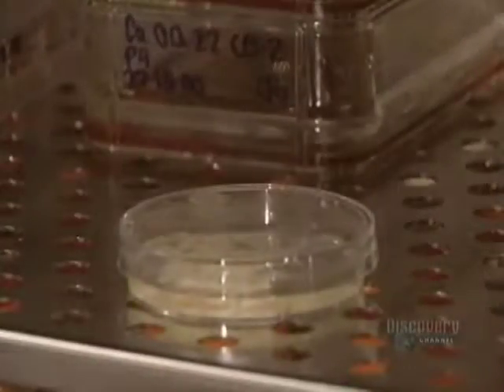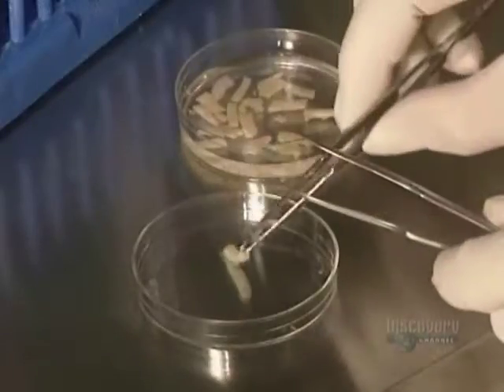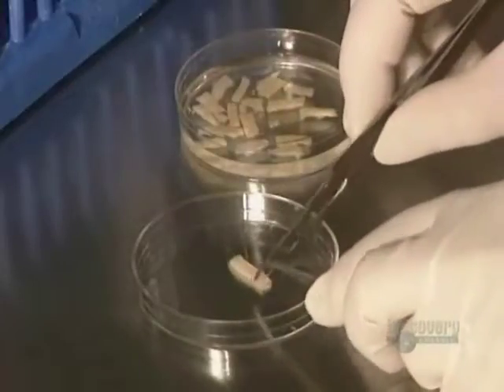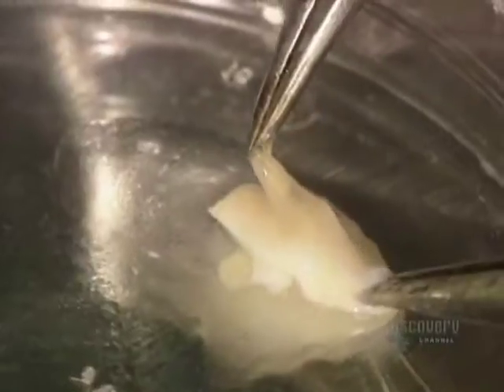Once incubation is over, the petri dish is removed from the incubator. Only the epidermis cells, also called keratinocytes, are retained. The epidermis is detached from the dermis with great precision.